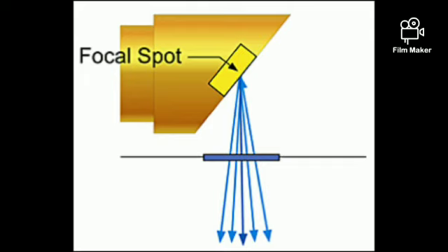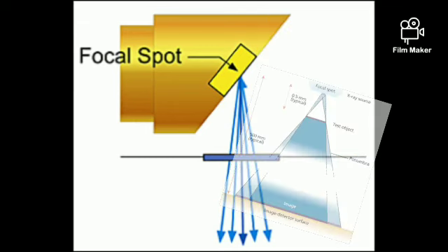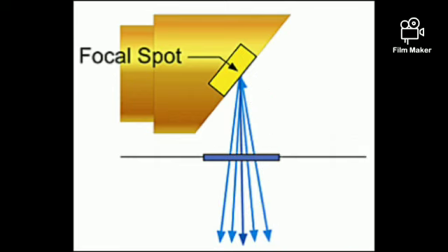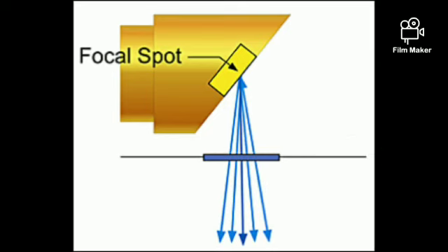The main purpose of measuring focal spot size is to produce a sharp image and to lessen our penumbra. If penumbra is more, the sharpness of the picture will be bad and it will give you a bad quality of image. Also, larger focal spot areas are very helpful in removing the heat from the X-ray tube very quickly.